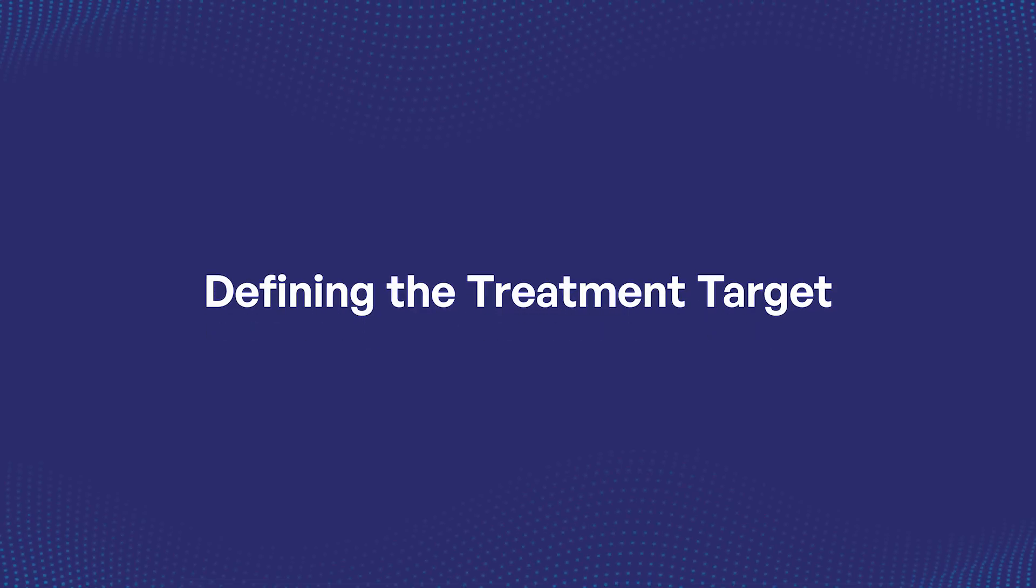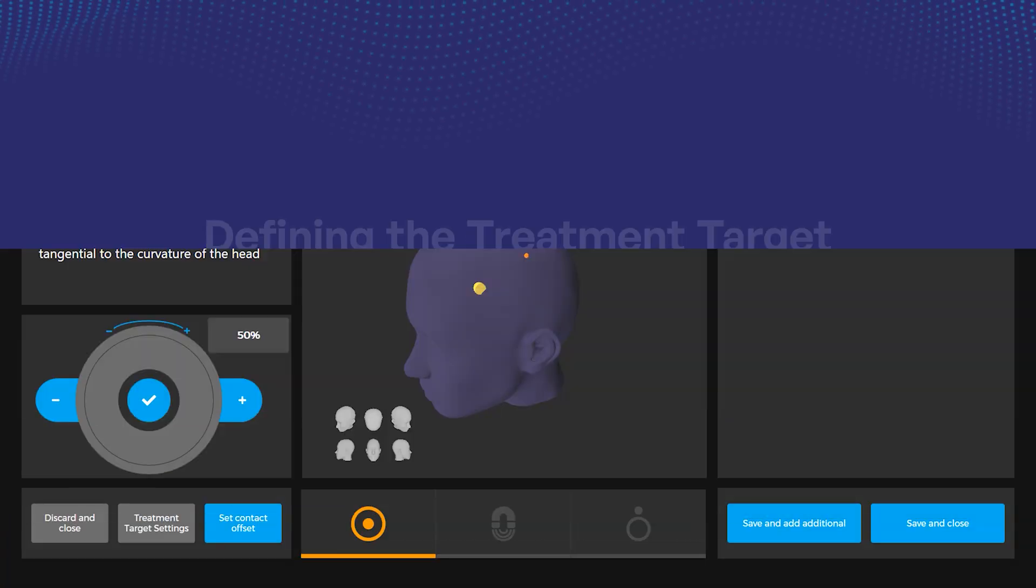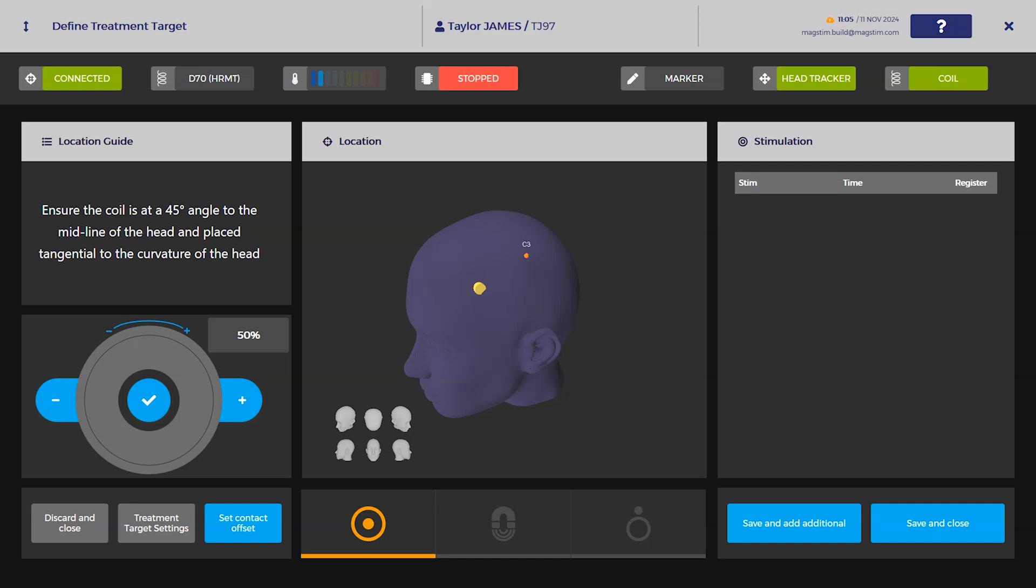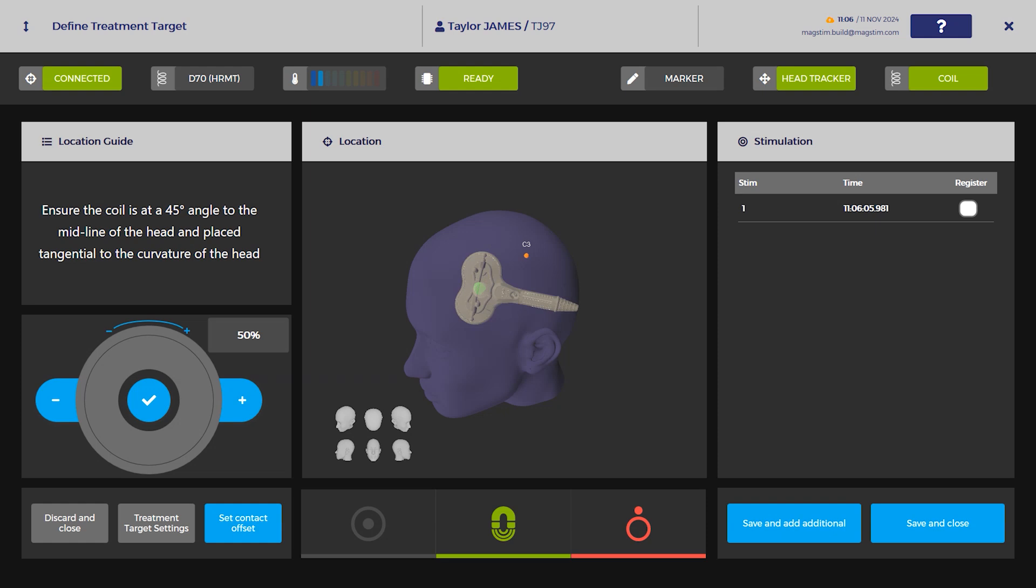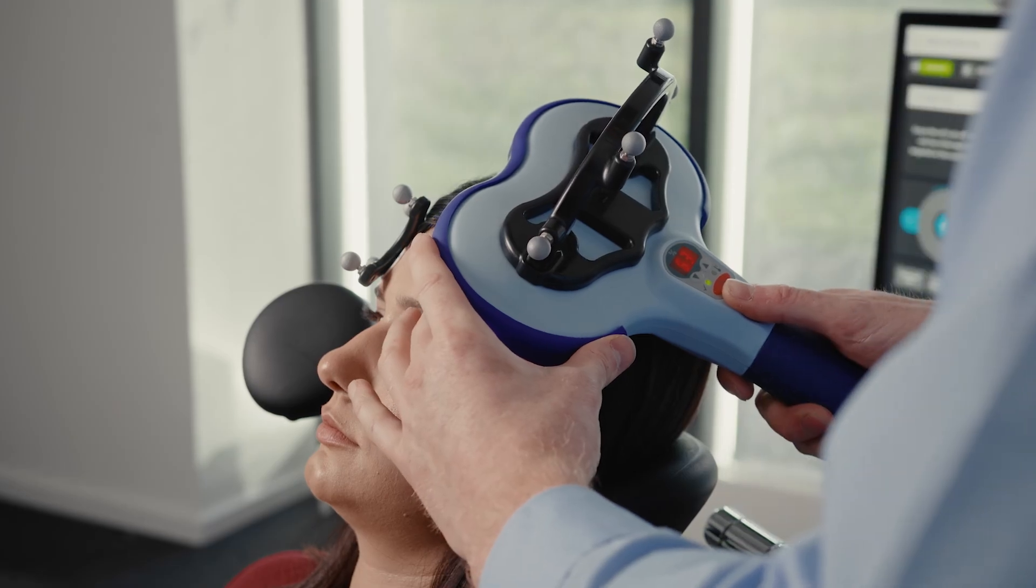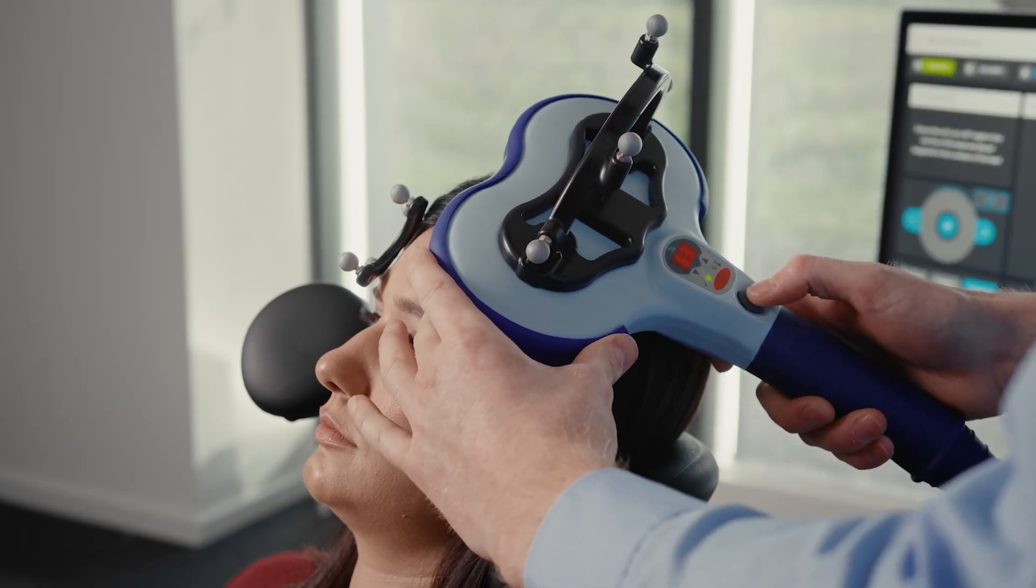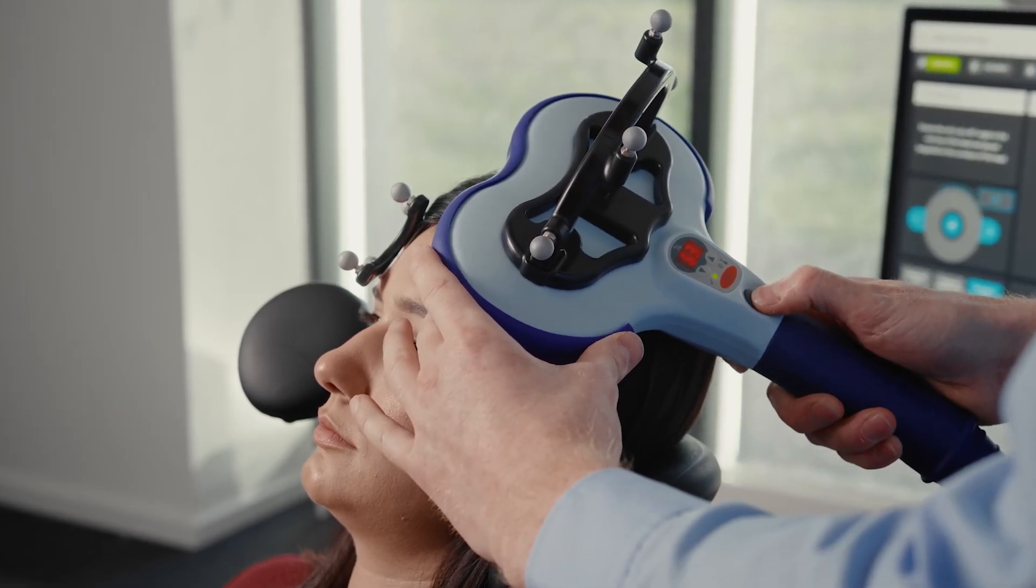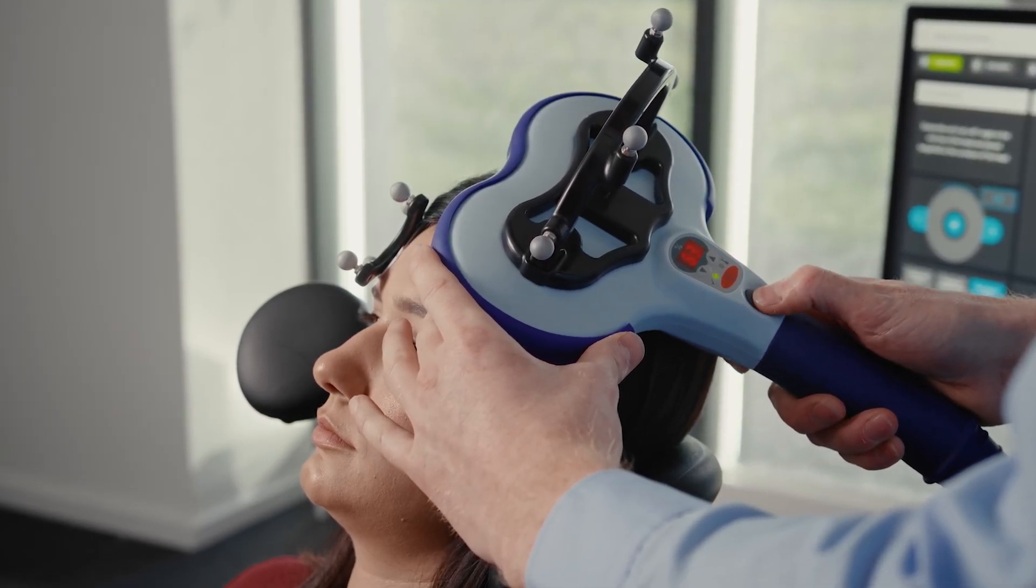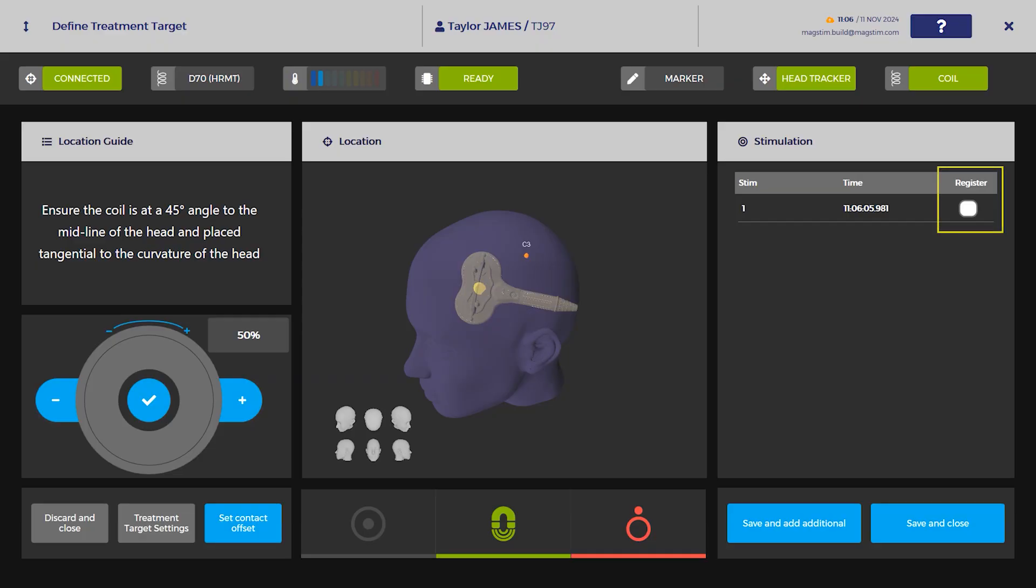Defining the Treatment Target: Place the MT coil on the treatment location displayed by the yellow cylinder, ensuring that the coil is placed at a 45-degree angle to the midline of the head and placed tangential to the curvature of the head. Once the coil is within the acceptable tolerance, the cylinder will turn green. Deliver a pulse on the target location. Register the delivered stimulus by selecting the corresponding register box in the stimulation window.